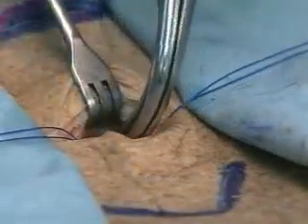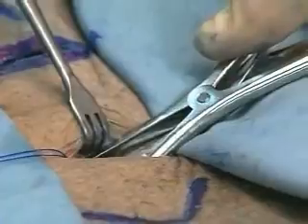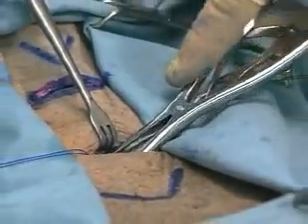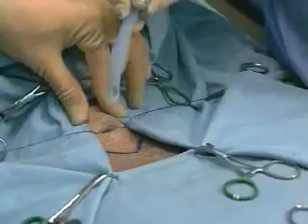The trachea is incised longitudinally. The opening of the trachea is then spread using a tracheal dilator. For urgent tracheostomy, a number 6 endotracheal tube or a tracheostomy tube can be used.